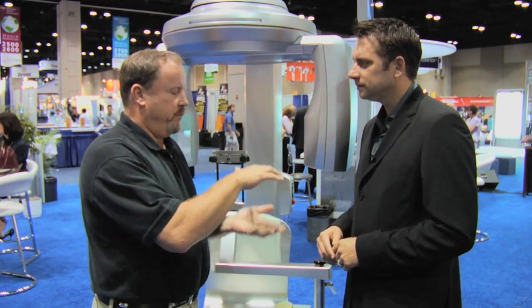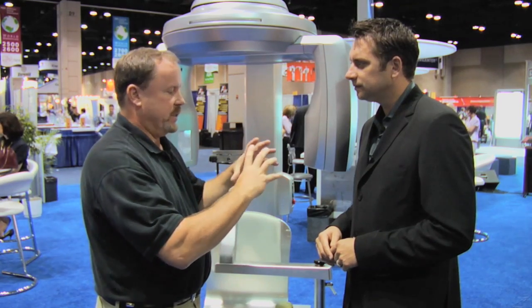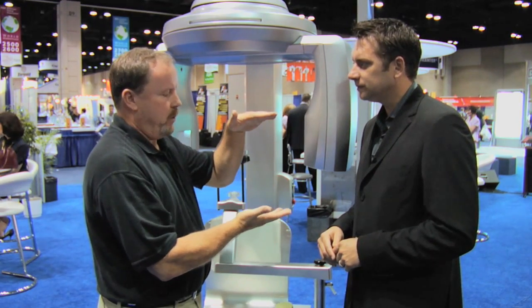Let's talk field of view. Field of view is the actual size of the scan you can get. Some scans you can get the whole head; in a lot of systems they'll go as small as a 4-centimeter cube. As the field of view decreases, in most systems the resolution goes up. In a real big field of view you'll have a resolution of maybe 0.5 or 0.4 millimeters. On the Prexion system, the resolution goes down to 70 microns, so 0.07 millimeters.